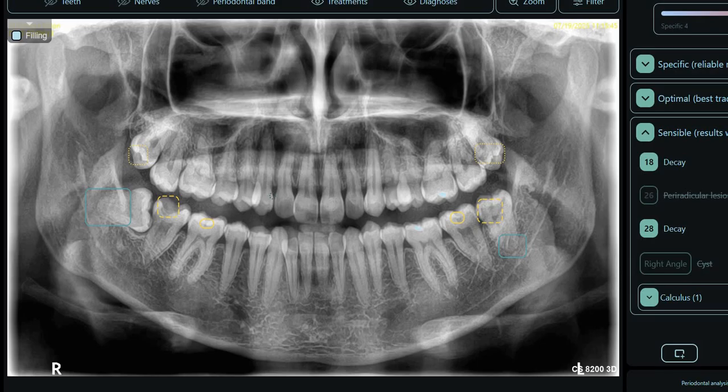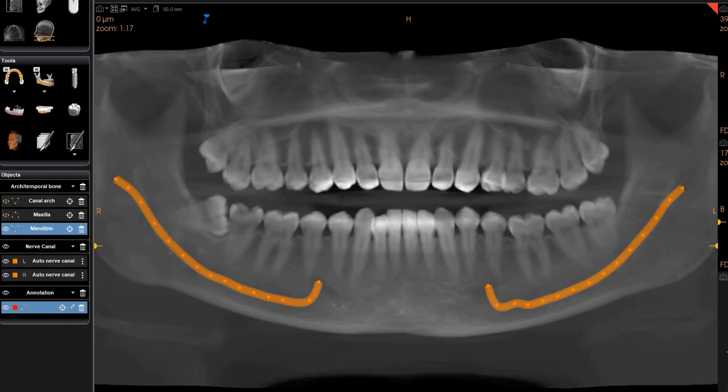So overall, I wanted the audience to understand and correlate how AI is absolutely revolutionizing dental OPGs and how it's helping doctors diagnose better, how we are trying at Ultrascan to correlate that information and make sure how valid that information is. You can't trust everything 100%, but when you correlate 2D with 3D, it actually helps you as doctors to understand and diagnose better, for better treatment planning, and to give your patients the best.